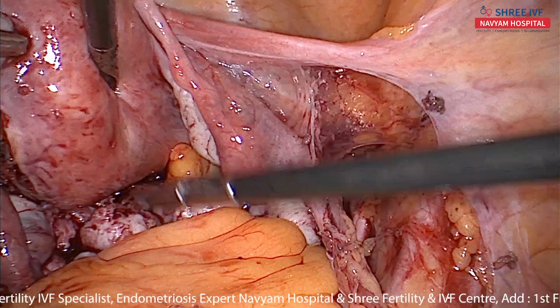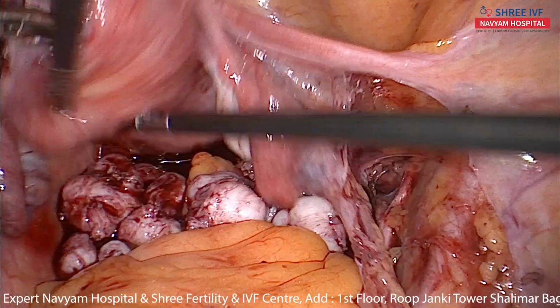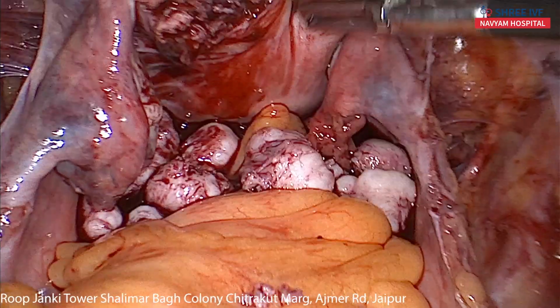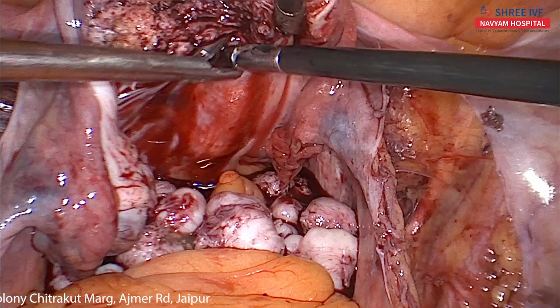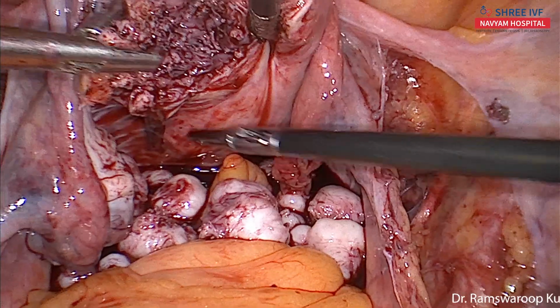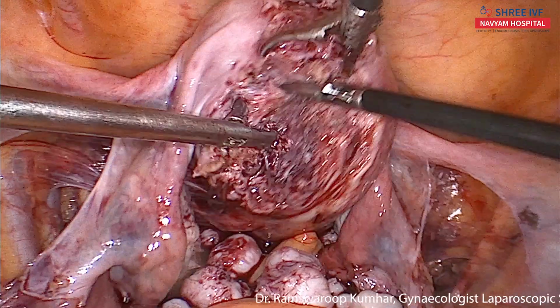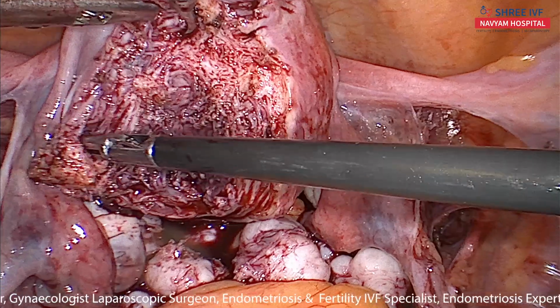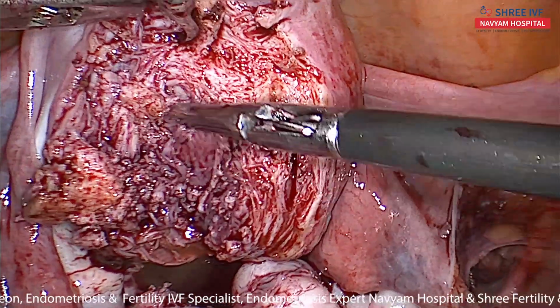Okay, search for any myoma. Is there? This is a smaller one, no problem. There is the cervix behind. This is the cervix. Okay. Is there any myoma at this site? No. This is the cavity.